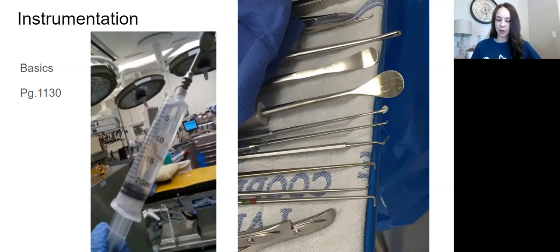So they all go hand in hand, but I want you to be familiar with all your different types of rongeurs. So I focused on Kerrison, the handheld ones. You'll see in figure 24-3. And then your bigger, like the Adson rongeur and other different big handheld rongeurs, those will be more in your orange book, so you can look at those in there. After that, I want to point out what I told you in ENT surgery.